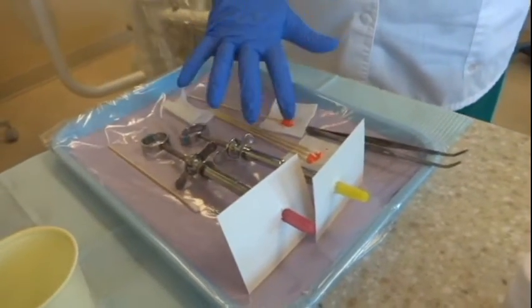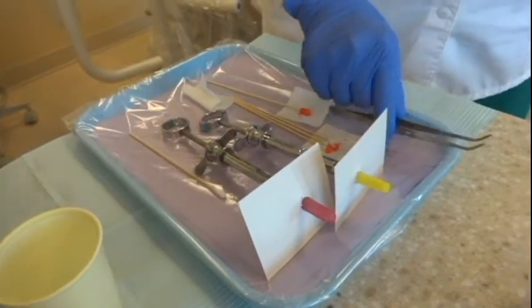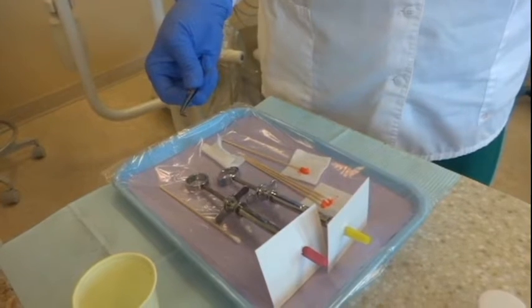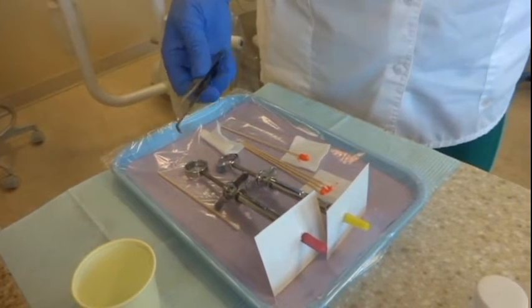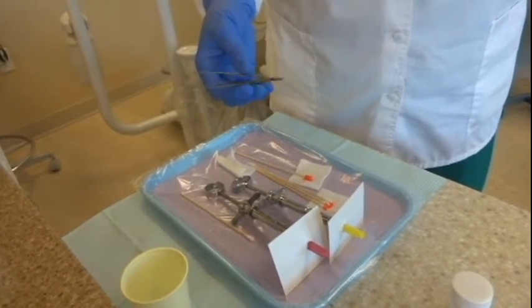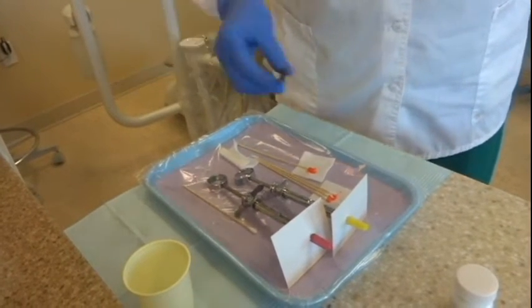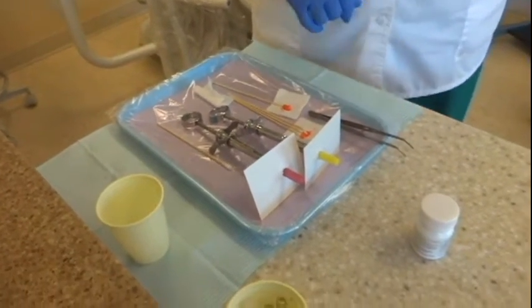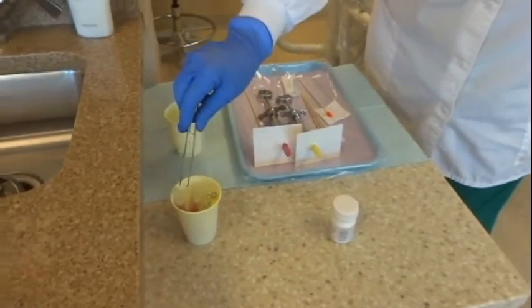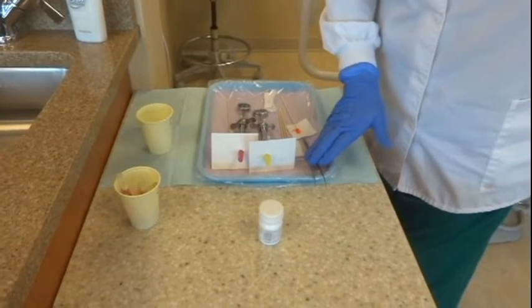So we've got our gauze squares, our topical, our extra Q-tip. Last but absolutely not least, the most important thing that you have to have on your tray is cotton pliers — locking pliers is what they have to have for boards. If you don't have this on your tray in lab, you're going to get marked down from day one. If you don't have this on your tray at boards, you're not going to be allowed to give your injection. I like to hang them off the edge like that so the very tips don't get contaminated — that way if I need something, I can pick it up and not contaminate anything else.